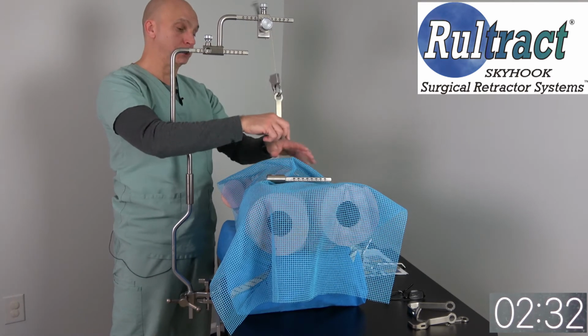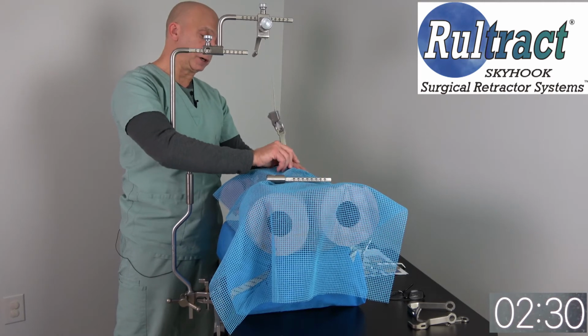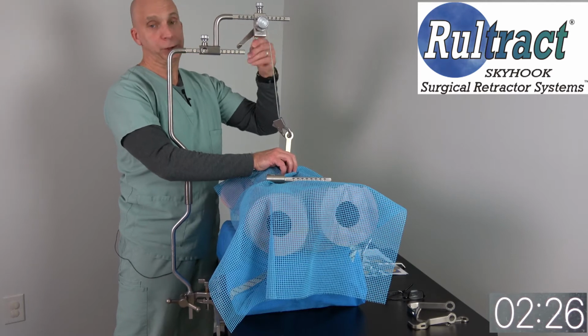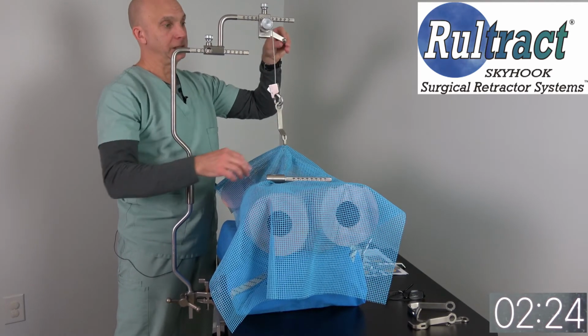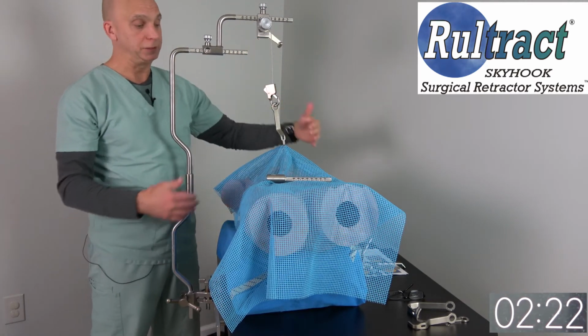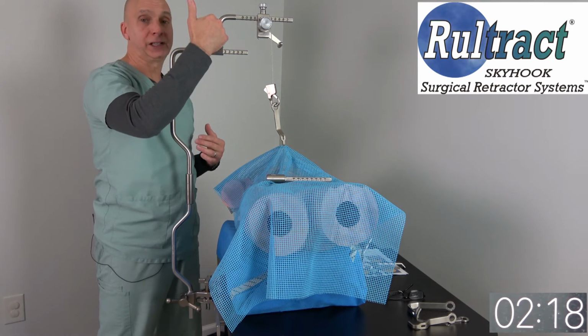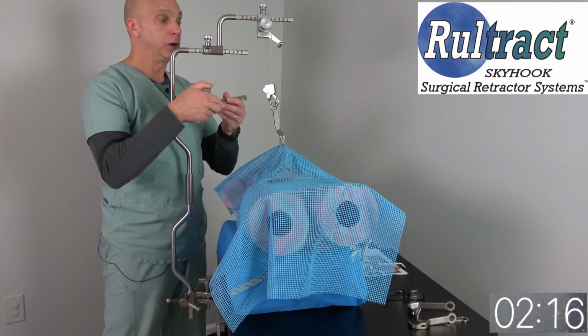So here you can see we'll drop down to the pericardial windows incision and retract. And we have plenty of cable left, even if we had a larger patient. So that is the advantage to having the riser extender bar over the standard.